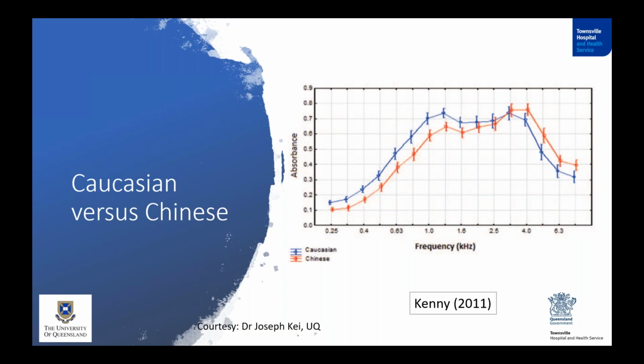Although one study has said that when assessing otosclerosis, ethnic-specific norms helped to differentiate otosclerosis better than having a combined norm. But most of the studies do not show a huge clinically significant difference. Statistically significant differences are found, but they're not clinically significant differences between the ethnic groups.